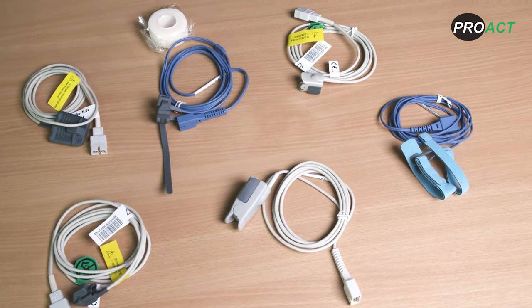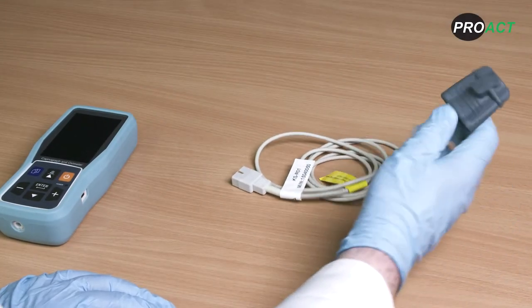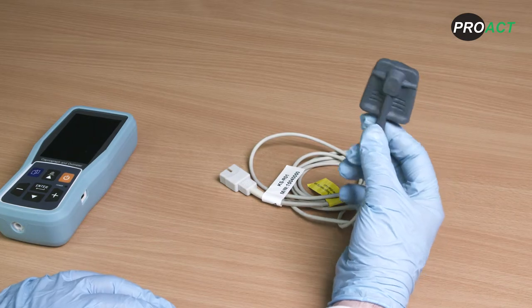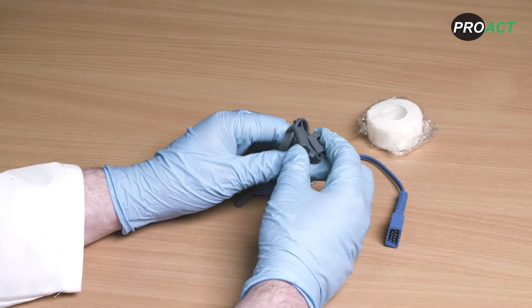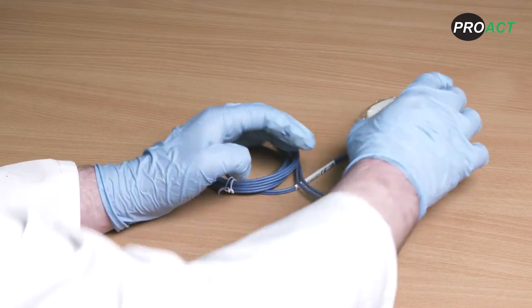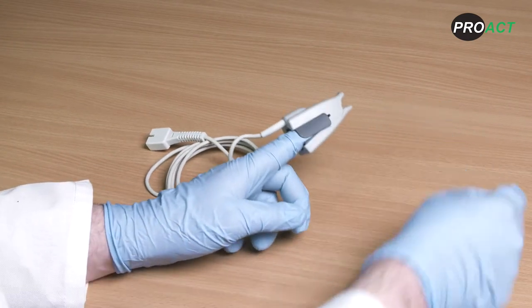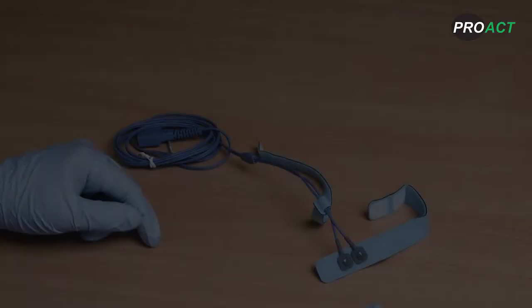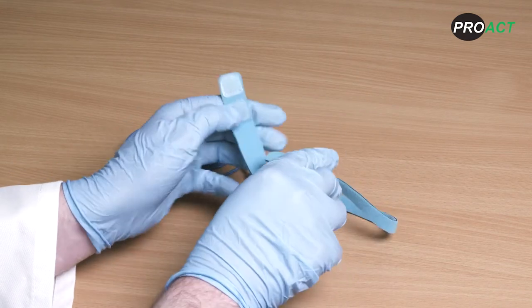There are a wide range of Creative SpO2 sensors compatible with the PC900B. These include the large silicone sensor offering an easy-to-clean, robust and comfortable option; the paediatric silicone sensor; the silicone wrap sensor that can be used on fingers or neonates and attached to the side of the foot with securing tape; the adult finger clip sensor; a paediatric sensor; and a velcro wrap sensor which can be used on fingers, the side of the foot, or on toes.